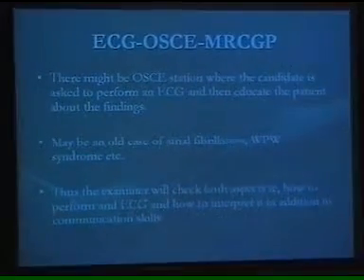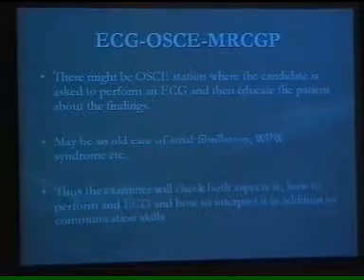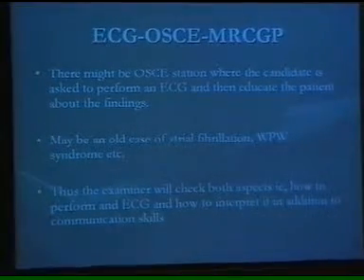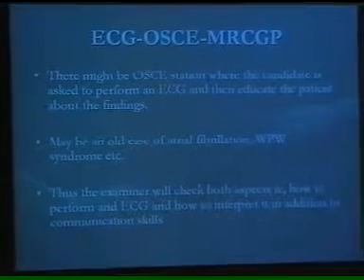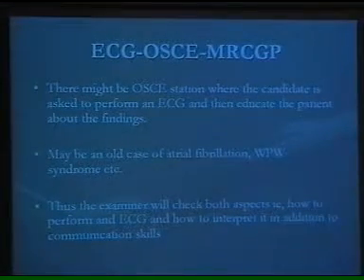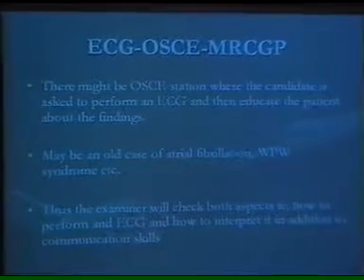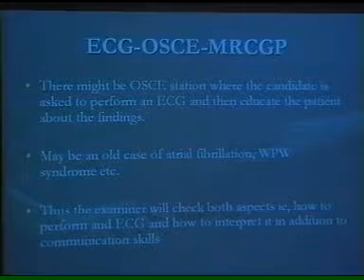There again ECG may be checked. You may have a station where there will be a patient lying on the bed, and an ECG machine lying there with all the things required, and the candidate may be asked to perform the ECG first, then interpret the findings and educate the patient. So they may check 3 or 4 things in one station: doing the ECG, interpreting the ECG, then communicating the findings to the patient.